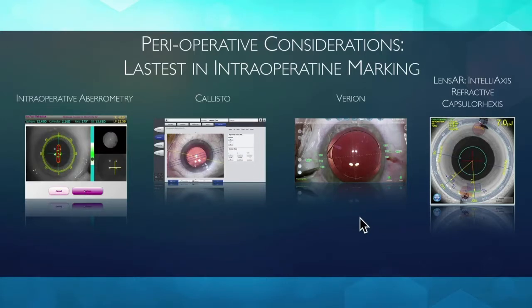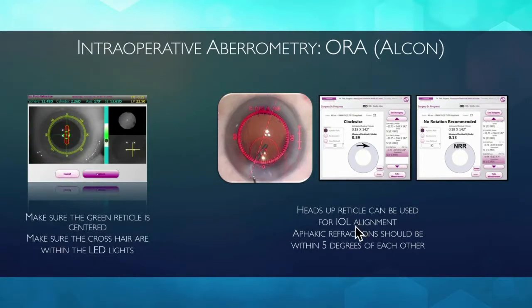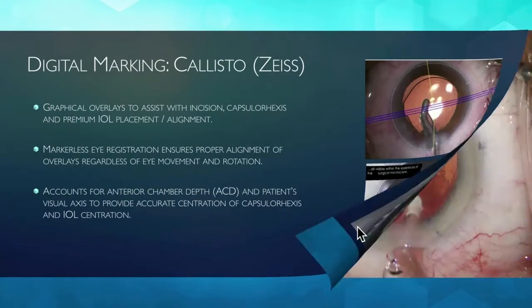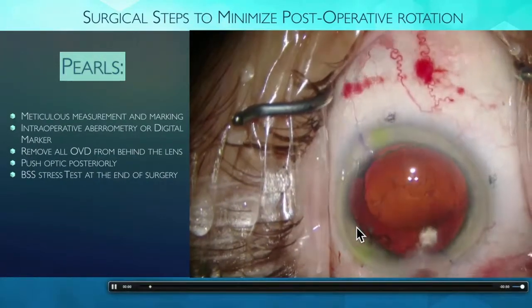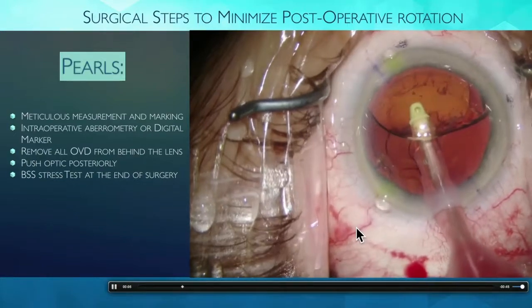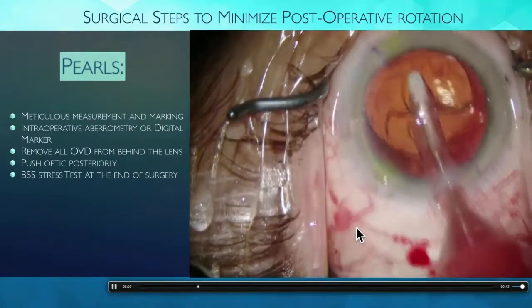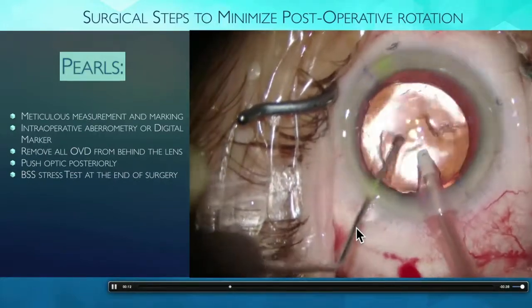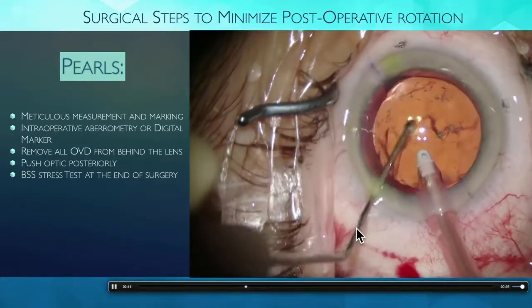Now, the digital marking systems, the intraoperative marking systems, are very nice, but they're also very expensive. I think if you have intraoperative aberrometry available and you follow the tenets of having a cornea that looks good, you can use it. There's also the Callisto that you can use, but I think surgical steps to minimize your postoperative rotation are going to be meticulous measurements and marking preoperatively, using some sort of intraoperative marking system, removing all the OVD from behind the lens, and then pushing that optic posteriorly after you get all the OVD out.